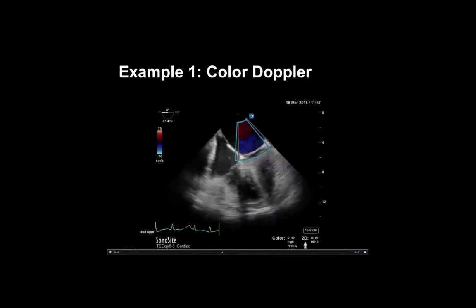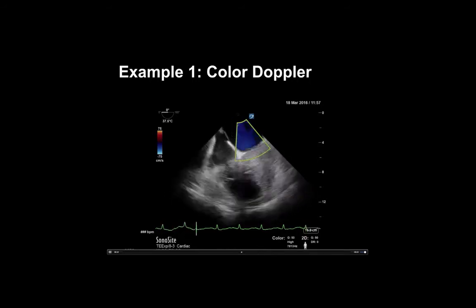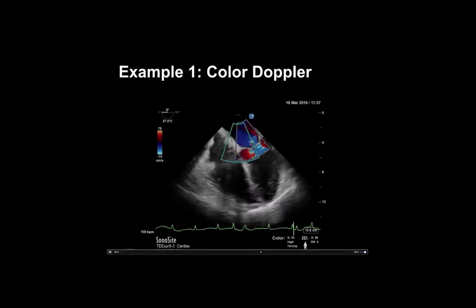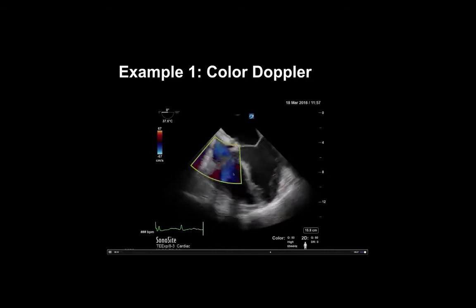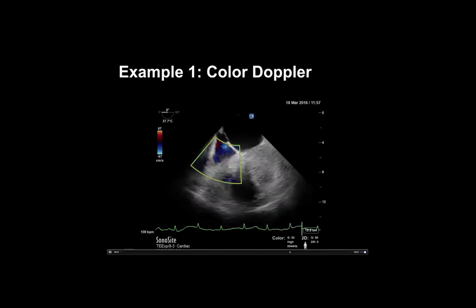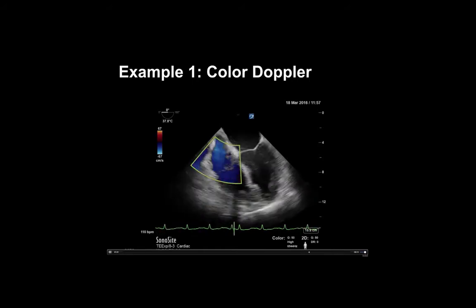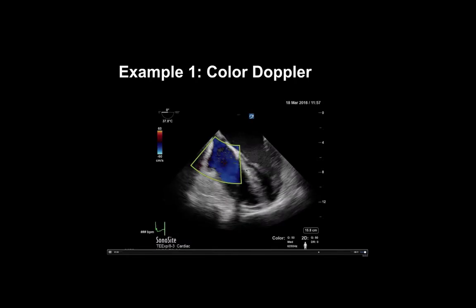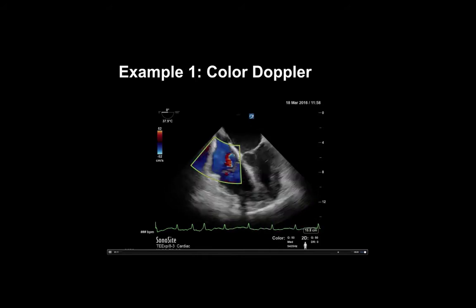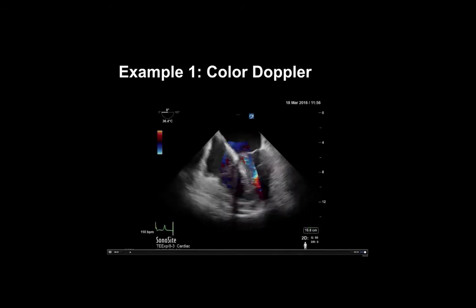And what they're trying to do here is assess for mitral regurgitation. And what you can see is they've made it the perfect size to cover the mitral valve and the receiving chamber of the left atrium, no bigger. And we're capturing just a trace amount of unimportant mitral regurgitation, that whiff of red flow there. You can see here now they move over to the tricuspid valve, and though our axis is far from perfect in terms of being parallel, we may capture a smidge of tricuspid flow, but I would be mindful in this example, if I was the operator here, that the flow seen here is likely underestimated because we're so far off axis. So this would be a common everyday example of optimizing color Doppler and both its pluses and minuses.